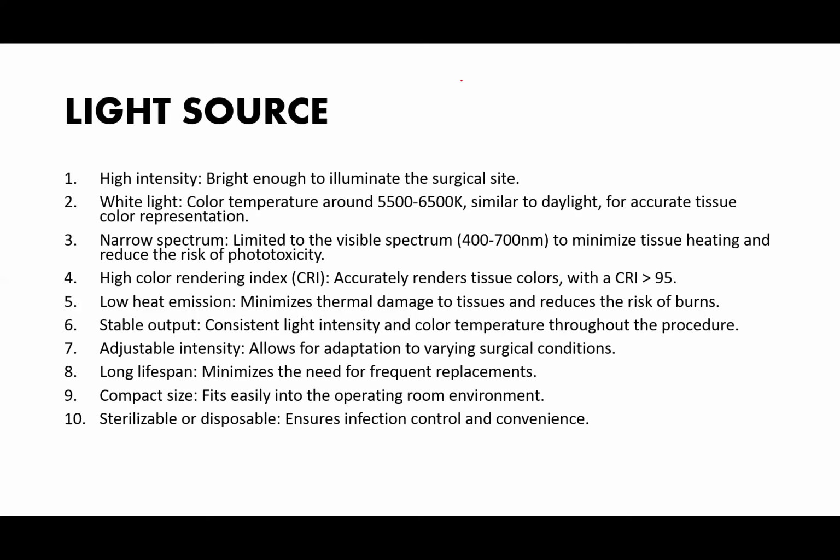Now, this light should be adjustable. It should have adjustable intensity, because sometimes when doing this procedure, if the light source is too much, you have spillage of light. There will be spillage of light. So it should be adjustable so that you can reduce or increase intensity. Now, it should have a long lifespan to minimize need of frequent replacement.